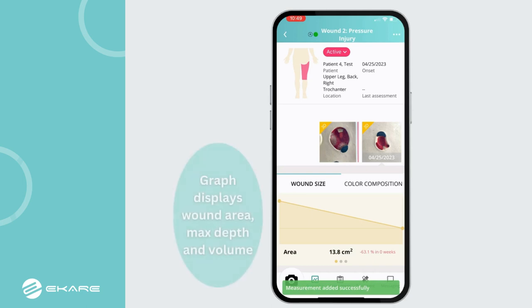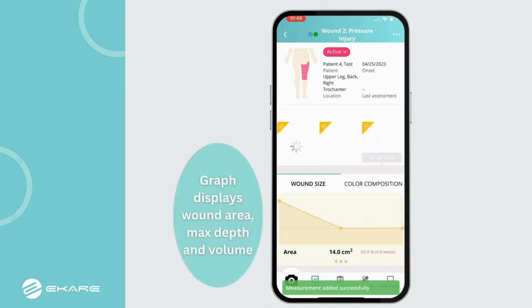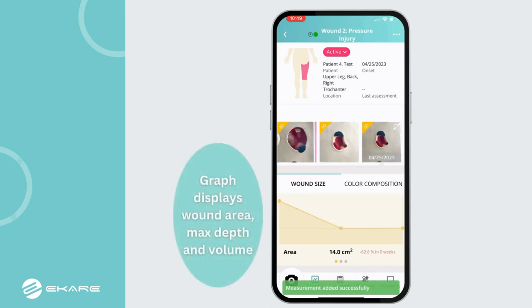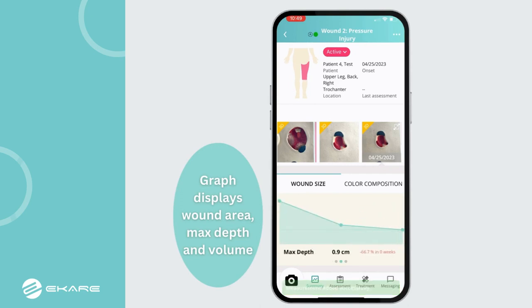Insight will immediately compute the measurements, including length, width, area, maximum depth, volume, as well as tissue color composition.